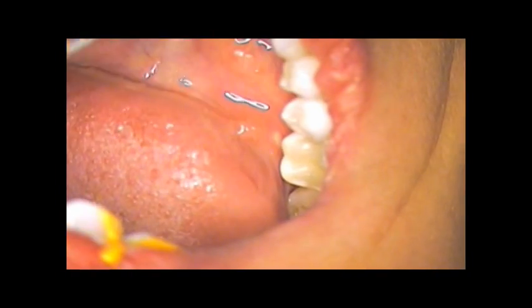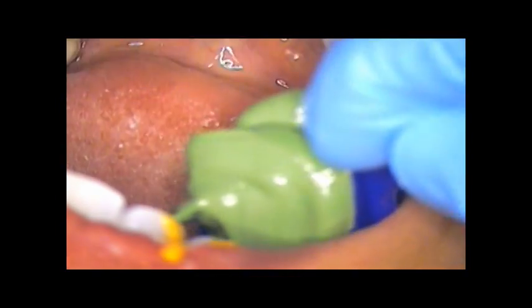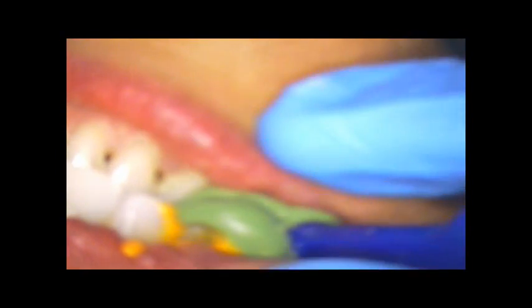Hi, we're back. We're now taking the impression. I've already removed the cord and now I'm injecting the first amount of the VPS and then of course the second. Getting ready to seat the tray, and this is a triple tray, and she's going to go ahead and just close straight down all the way, and we're just going to let it set for about 6 minutes.